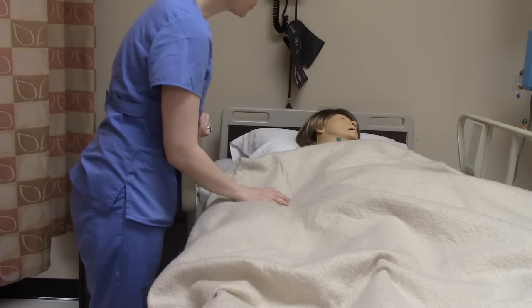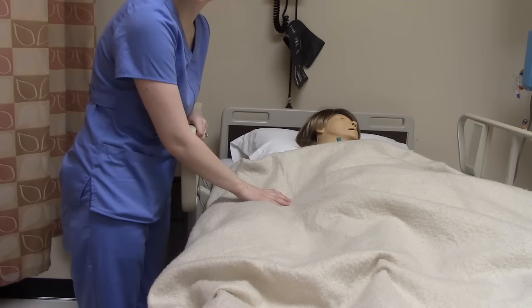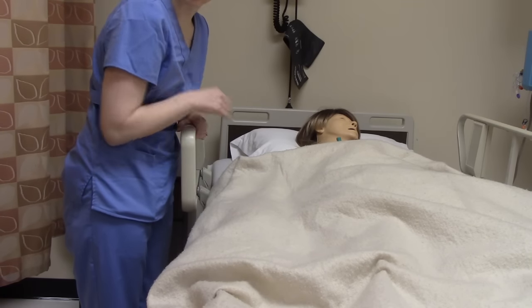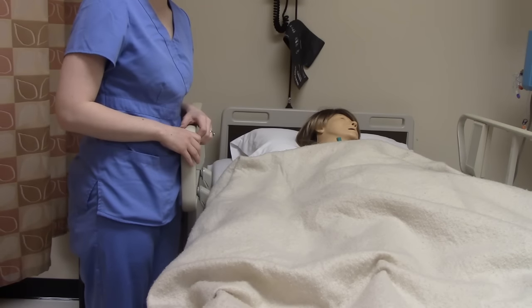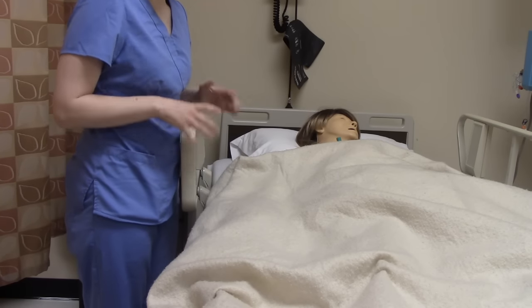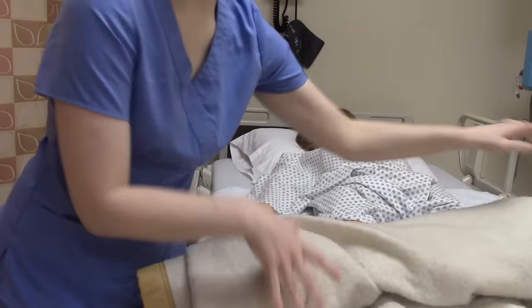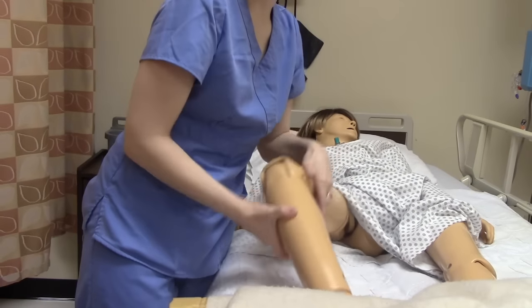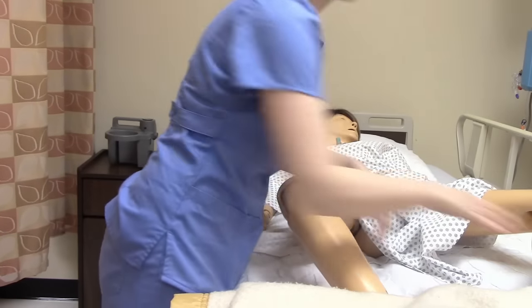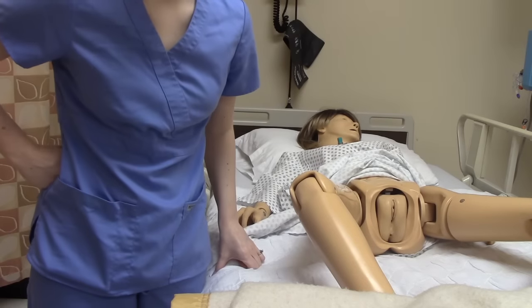Alright Mrs. Johnson, we're going to be inserting a Foley catheter into your bladder today. Is that alright? She says it's okay, so let's get started on our female patient. You want the bed at a nice working height so you don't have to bend over and hurt your back. Roll the blankets down and have them bend their knees and open their hips. The key to a good Foley is getting them in a good position and having good lighting.